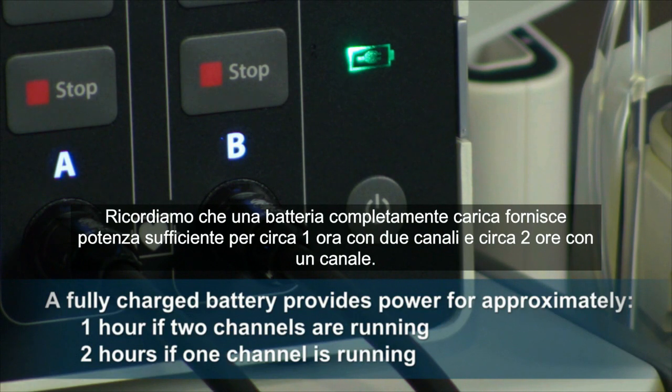As a reminder, a fully charged battery provides power for 1 hour if 2 channels are running and 2 hours if 1 channel is running.